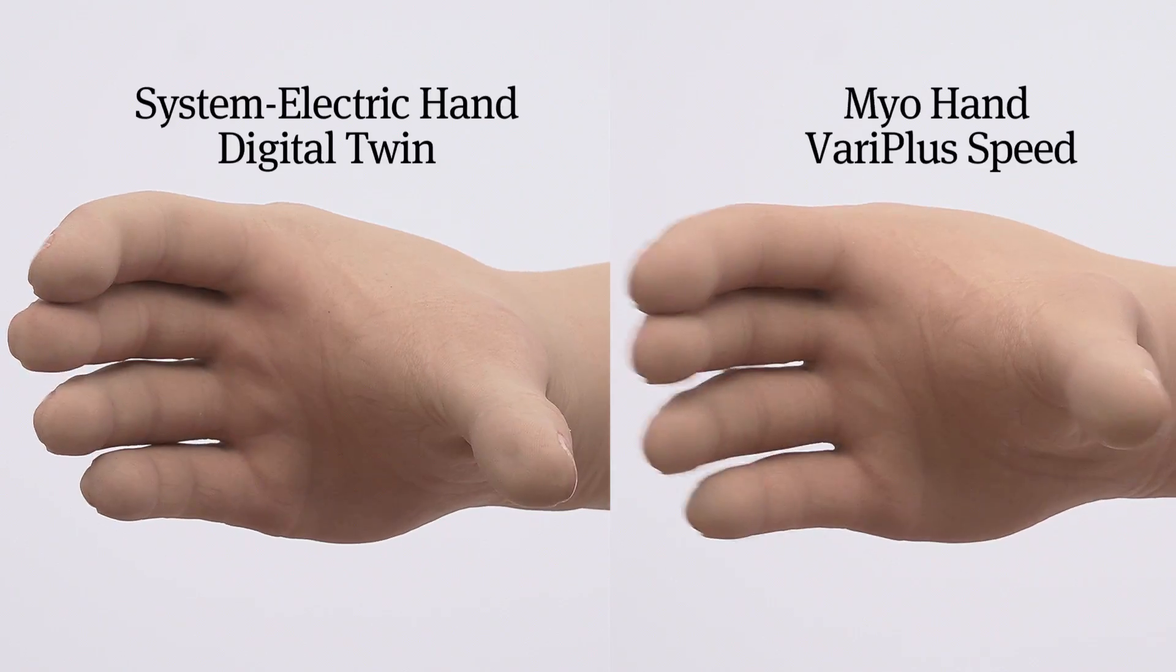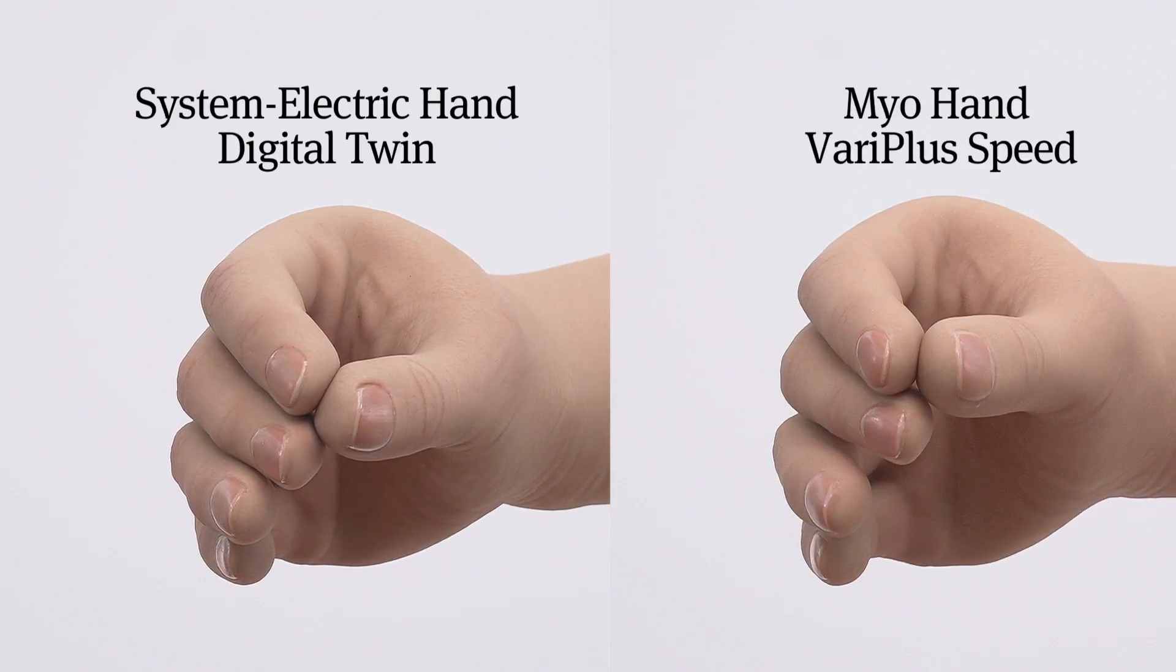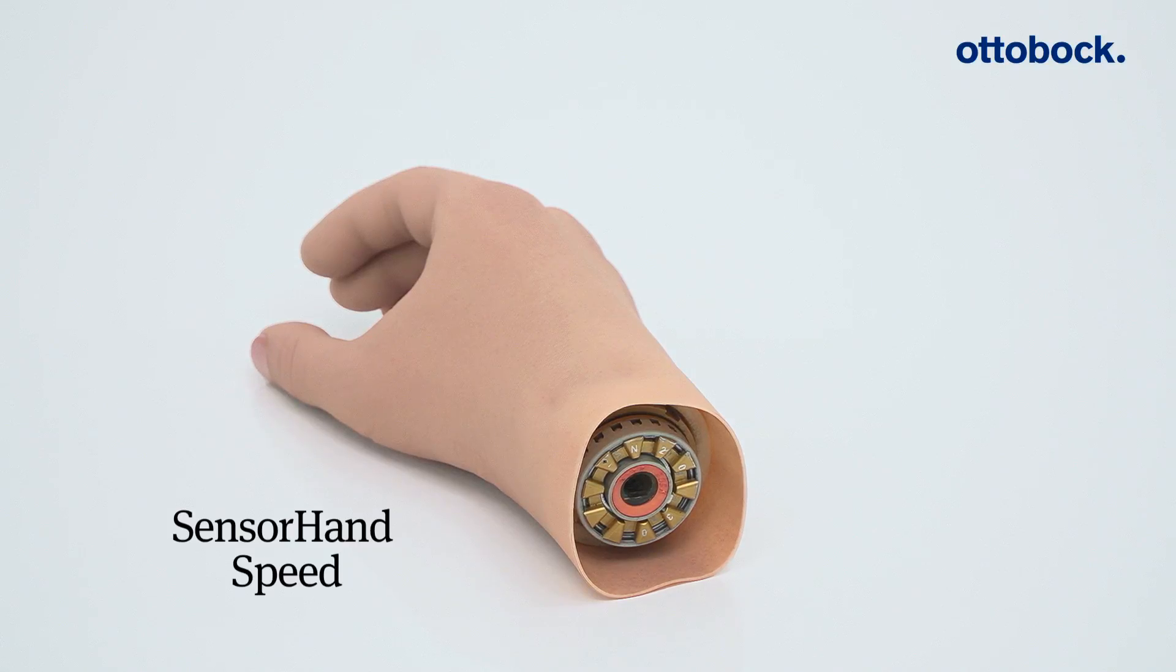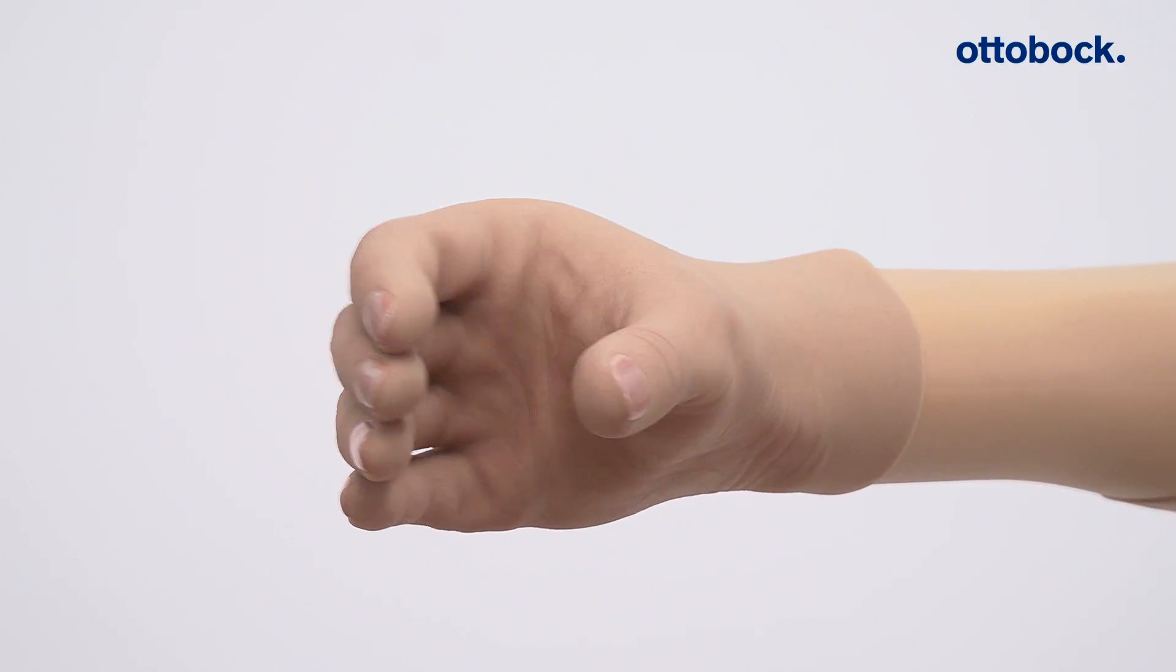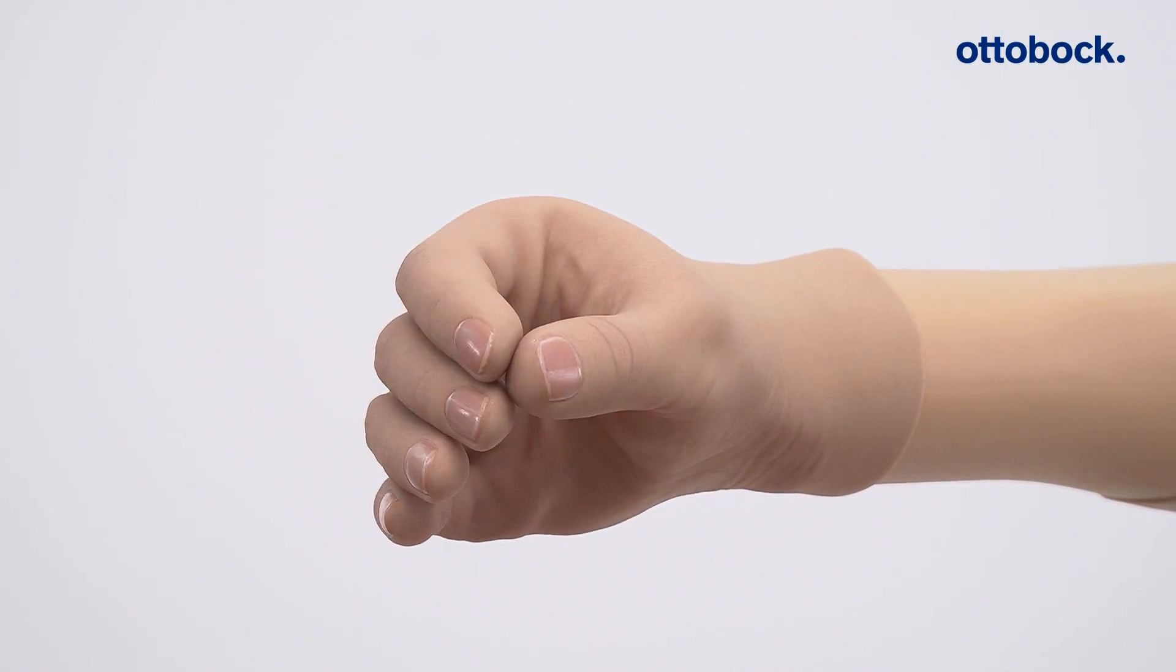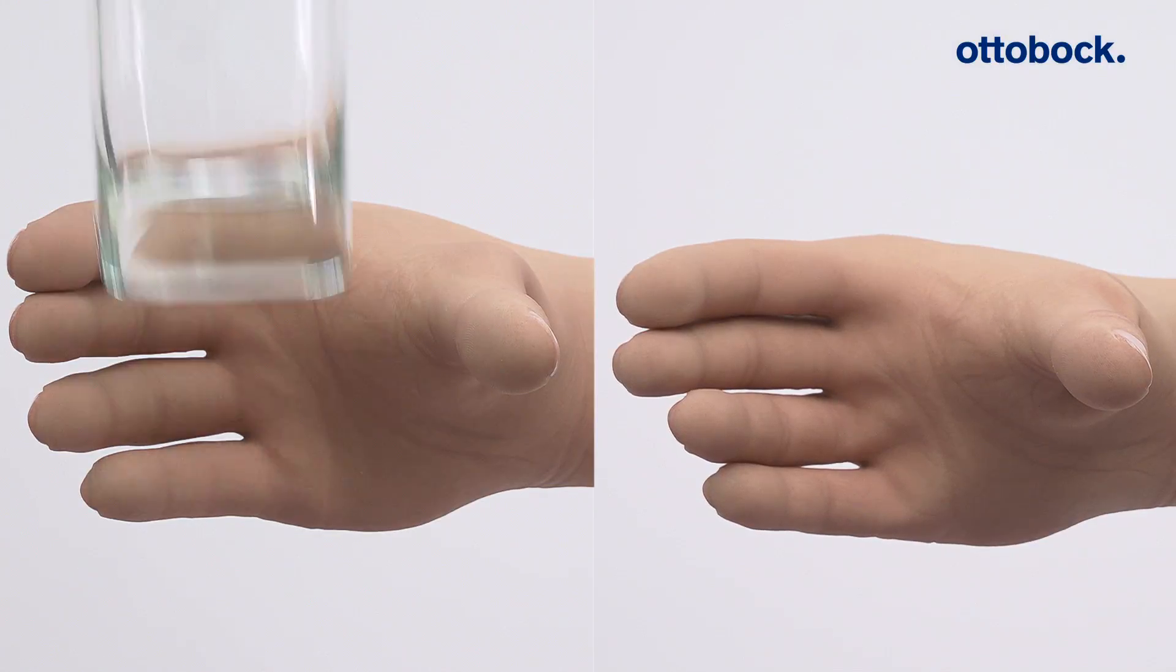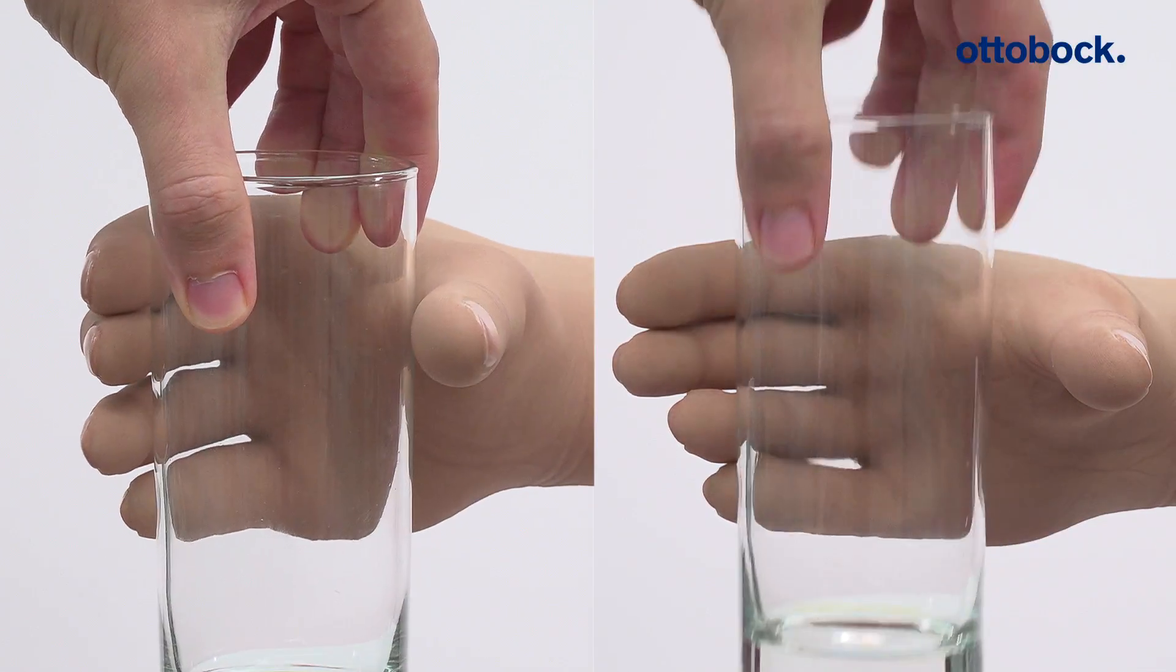The VariPlus Speed hand opens and closes more than twice as fast as other electric hands. The Sensor Hand Speed offers the same functionality as the VariPlus Speed hand. The Suva sensor technology integrated into the thumb instantly senses when a gripped object is about to slip.